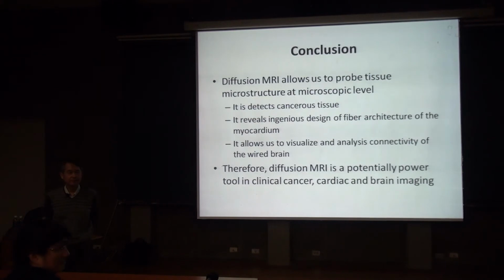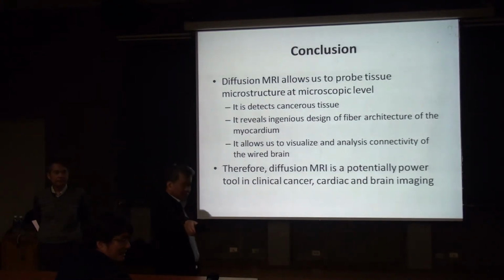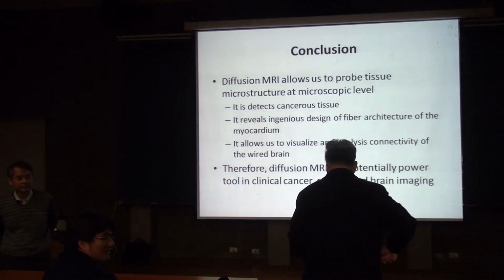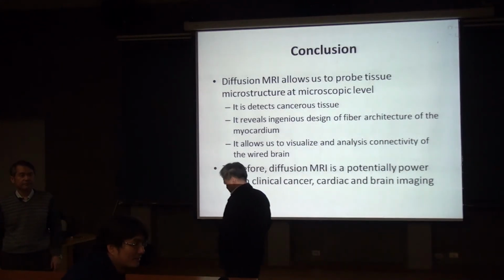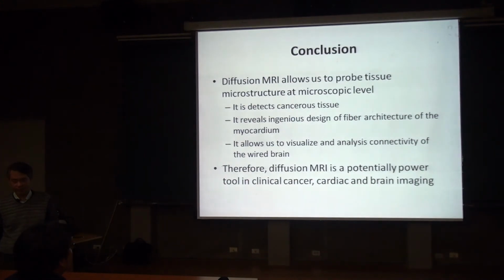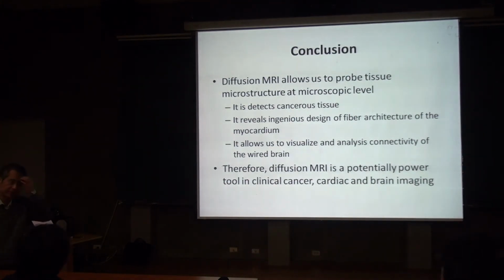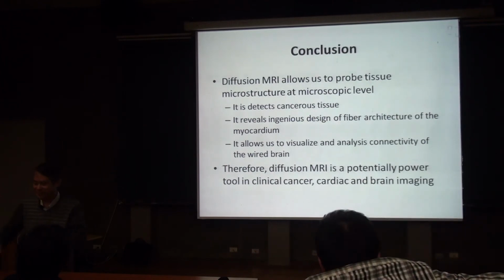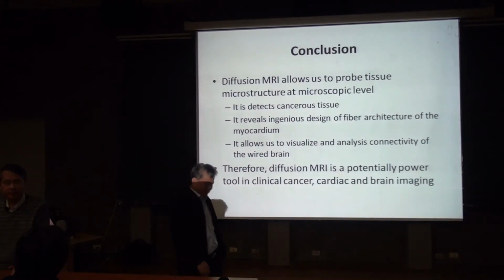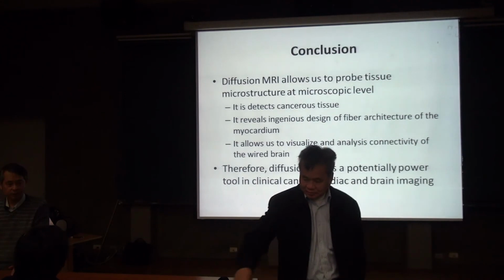Yes. So what's the spatial resolution you have for the brain, and what's the resolution you prefer to have in the future, and what's the limit there? Yeah, a very good question. This is a question from experts. Right now, the spatial resolution of our diffusion spectrum imaging is 2.5 millimeter cube.